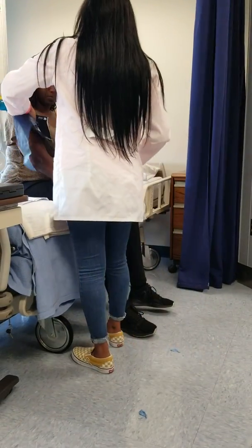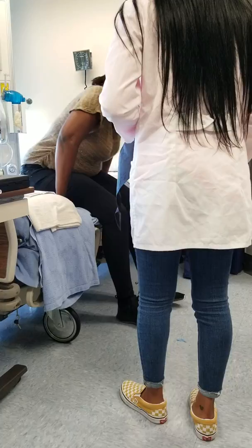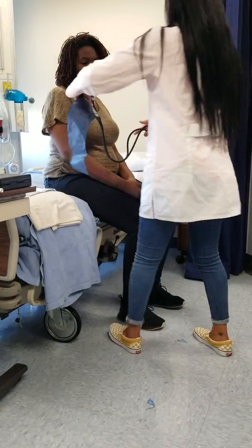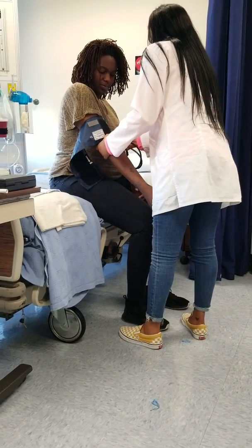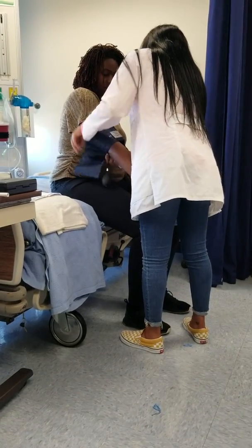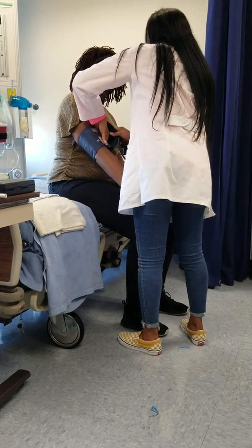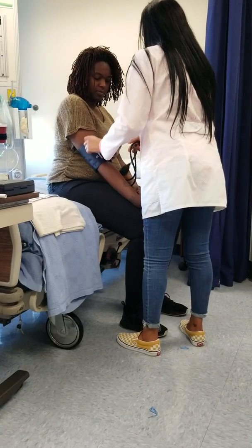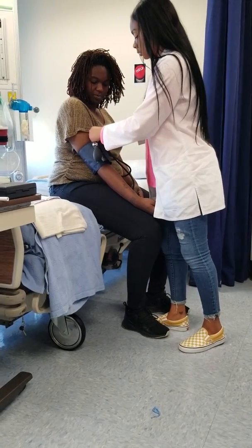I'm going to align. Can you scoot up with your feet like that? Thank you. Okay, great. It's very important that the cuff fits properly or you'll get a false reading.